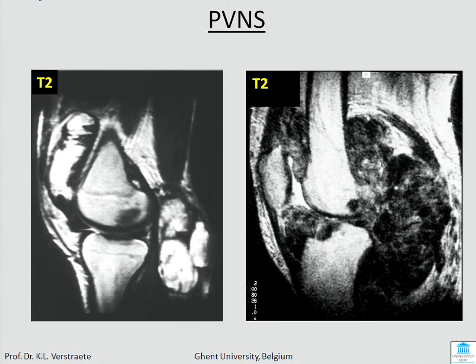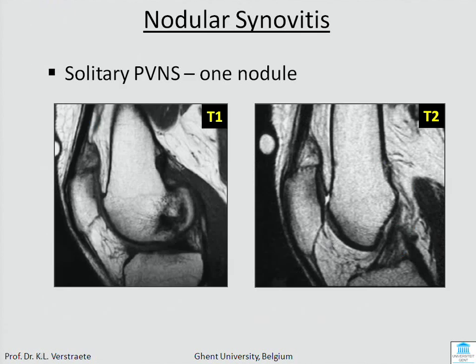Some examples: here we have pigmented villonodular synovitis — very dark on T2. This patient has a large effusion, whereas this patient has a lot of hemosiderin and almost no effusion. There is also a special form: solitary PVNS, which has the special name nodular synovitis. You will see a lesion with dark areas on T1 and T2, and this gives you the diagnosis. It's connected to the synovium of the joint.